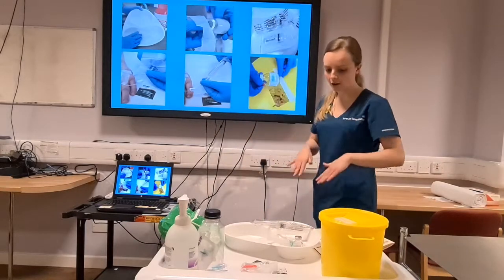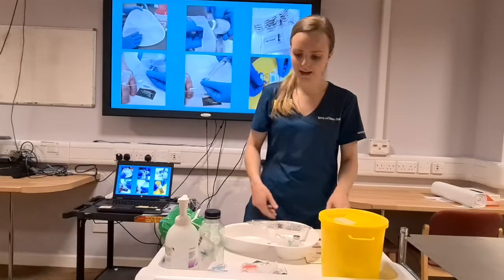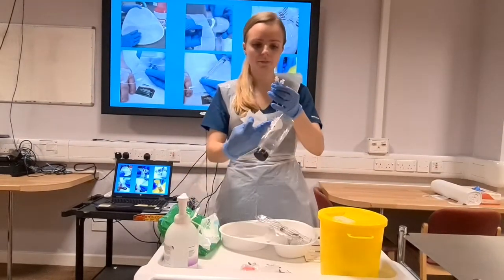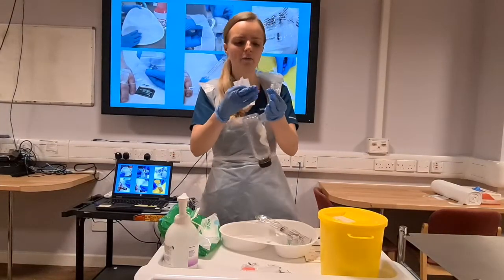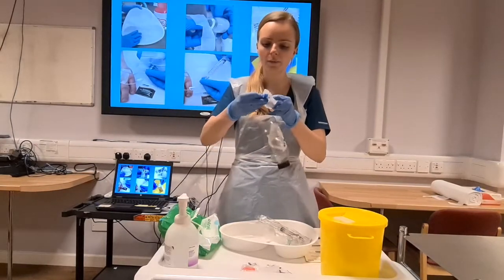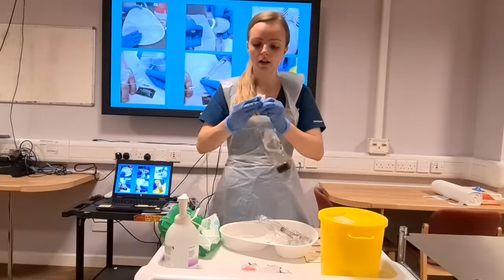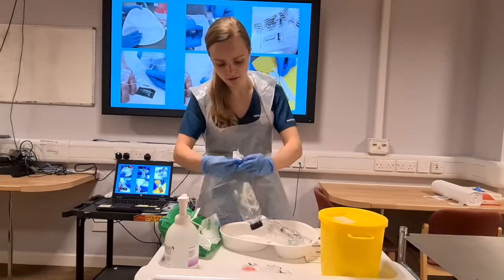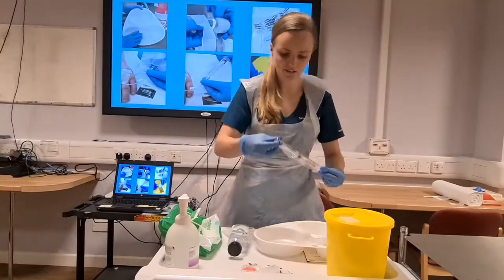And then going back to myself, I will go and give this to the patient. As I'm now going up to the patient, I will decontaminate my hands again. So my cannula here, I would always go upwards, go for the hub that's going upwards, and then that way you remember which one you have cleaned. So giving the hub a really good clean, only cleaning one hub because I'm only using one, using different areas of the wipe, like so, and then allowing to dry. I'm going to get my flush ready.